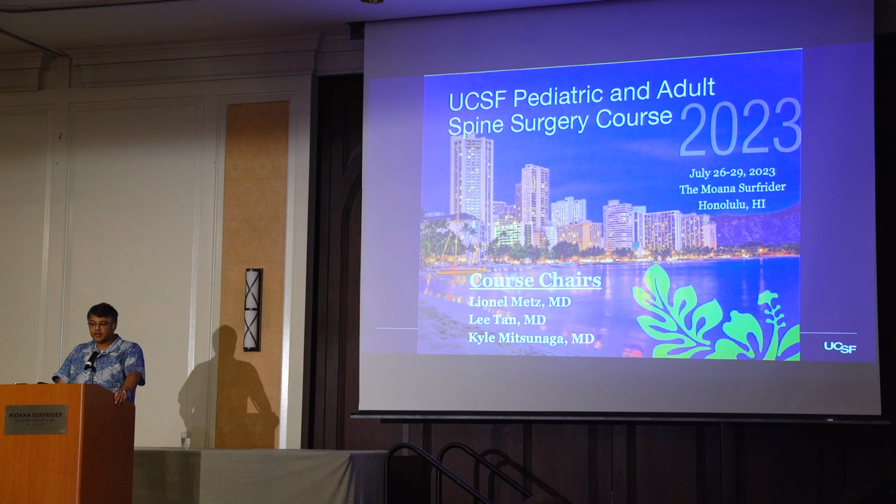I agree with you. It's uncomfortable to try to do a sublaminar pass underneath C1 with that cable. So I've been lately either putting a cross-link across the rod and putting the graft underneath, but sometimes the graft is so big it doesn't fit. But I've also been using some Surgilon and trying to just push the graft down, and I put graft also in the interfacet space. That's been working out okay.